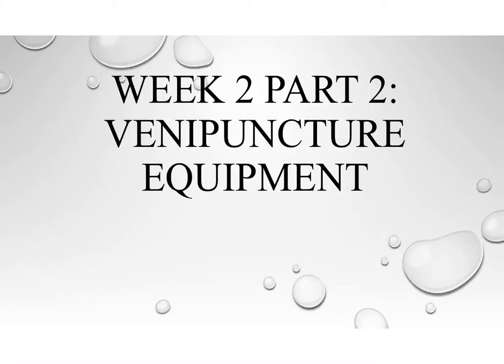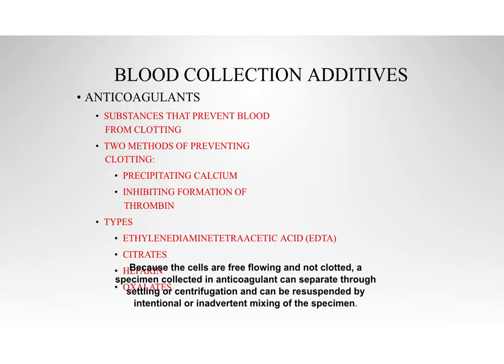This is week 2, part 2, venipuncture equipment. All right, so we're going to start talking about the additives that go into those tubes, those evacuated tubes.